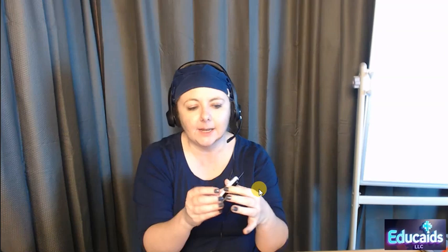Now, when I go to apply my sample, I'm not going to rub it on there anywhere. I'm not going to poke it all crazy. I just want you to put it really close and let the machine and the strip pull its sample. So you're just going to gently put it there, and the machine will tell you when it has enough sample. Oops. There we go. Wonderful.